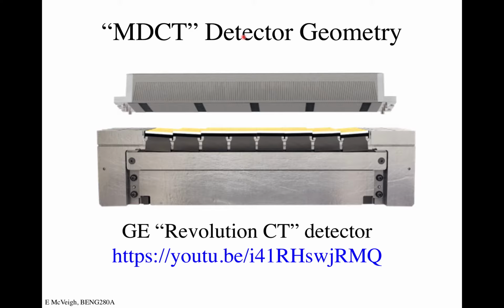And so that's called scatter. If you have a photon coming in this direction and it's going to hit the detector here and light it up, your system will think it came from up there. So you want to eliminate that photon. Ideally, it never makes it past this grid. It gets absorbed by the anti-scatter grid. And it's an important feature. Ideally, you have infinitely narrow cells that have fantastic attenuation of X-rays, right? That's what you would like.